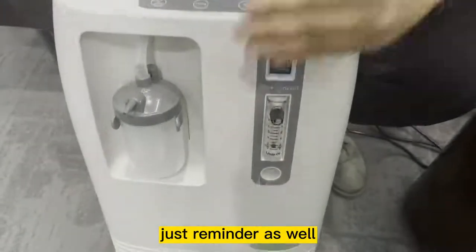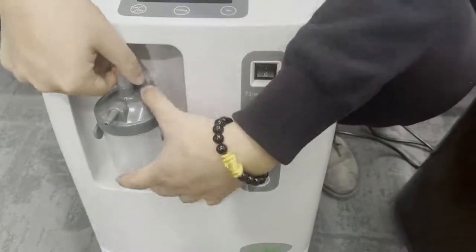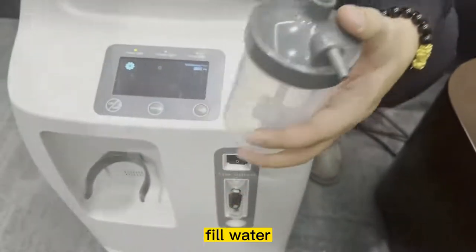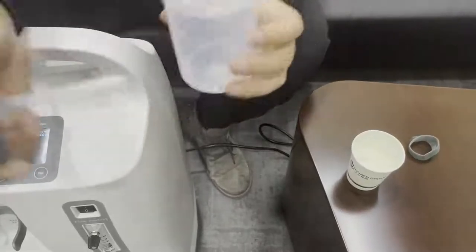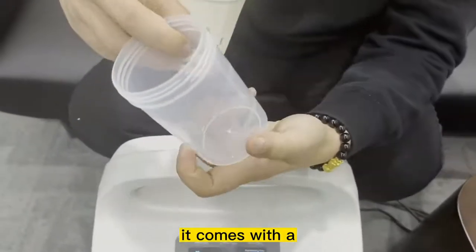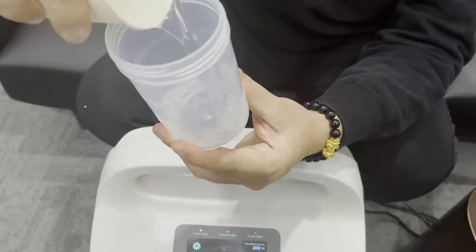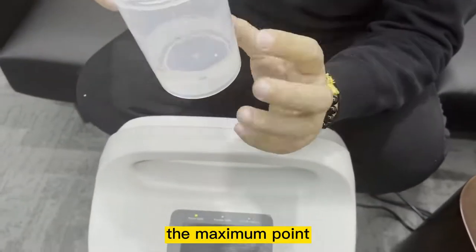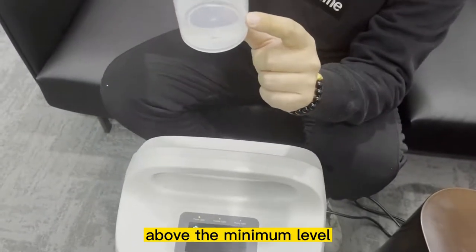Before doing that, it's a reminder to actually fill up the humidifier bottle with water. All you need to do is take out this bottle and fill it with water. It comes with a minimum and a maximum water level marked on it — just pour the water and make sure the water level is in between the minimum and the maximum point.